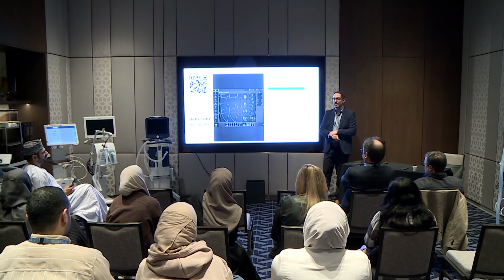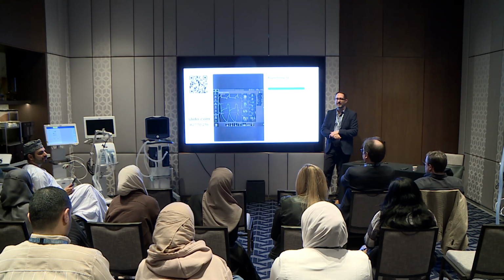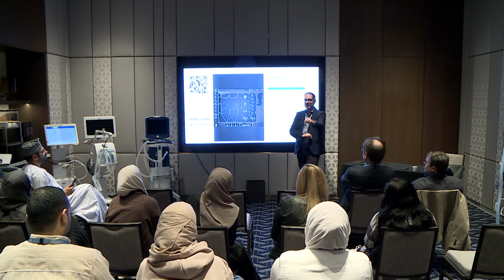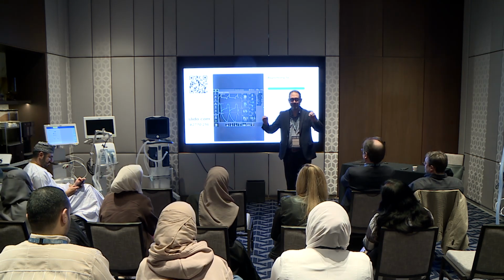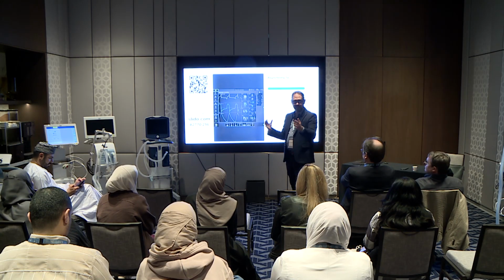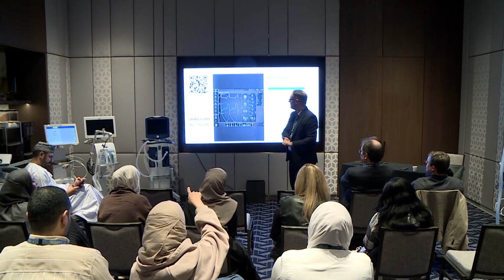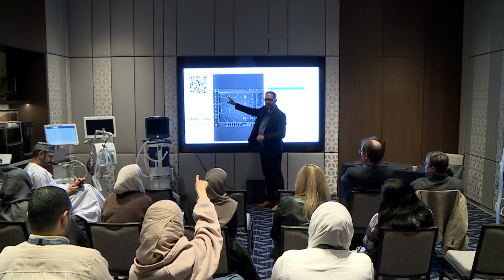Does anyone want to tell me why they chose under assistance? Early cycling. What's that? Early cycling. It is not early cycling. It's late cycling. Now, question, what made you think it was early cycling? Because this is a learning. Everyone here, there's no judgment here. I want you to leave here confident. So I want you, if you can explain to me why you chose early cycling, I can maybe explain why it's not. But I want to know where your thought process was first. Yes, graphic of the flow. Yeah. No, was this what, sorry. You're looking up here, pressure? Yes, pressure. Yeah.